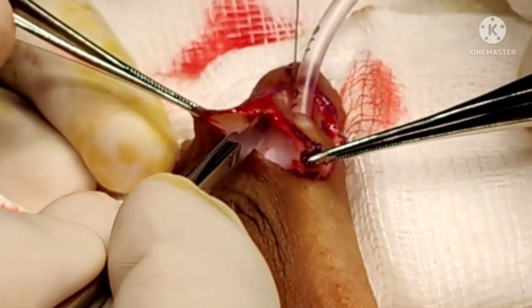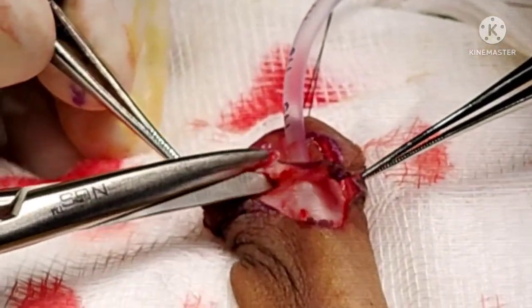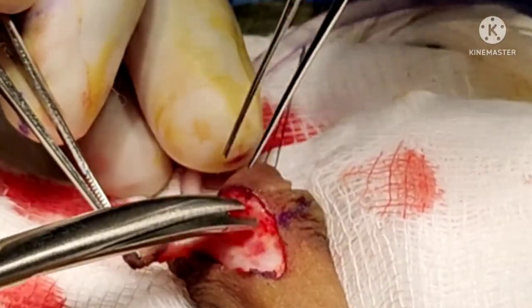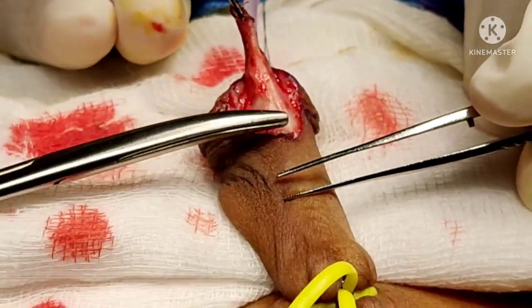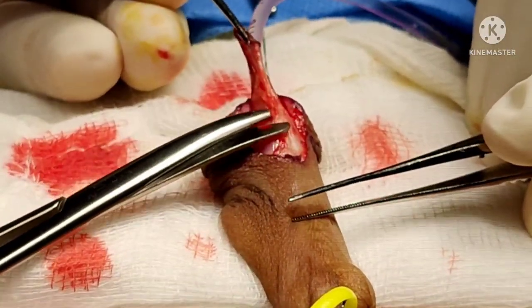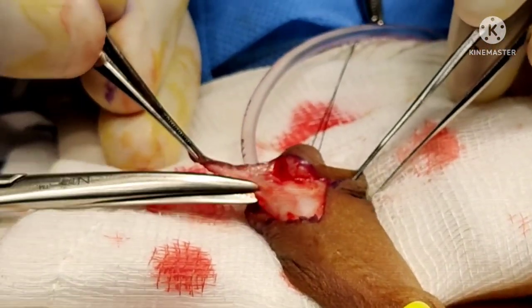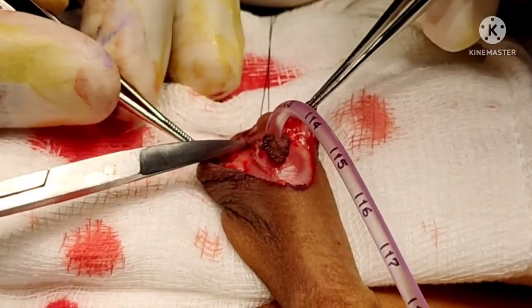Here we are keeping a ventral tongue of skin which we are going to hold to mobilize the urethra. If the urethra is not mobile, we can actually use this as a Mathieu flap. But in this case, the urethra is quite mobile. You can actually see that as we release the dartos bands, the urethra comes very close to the normal location.